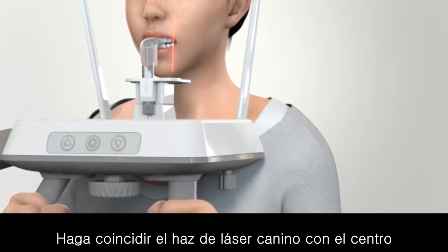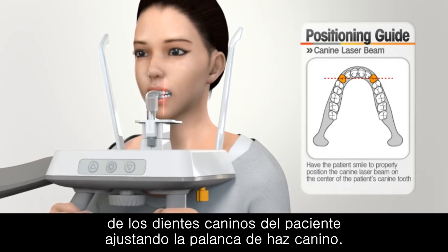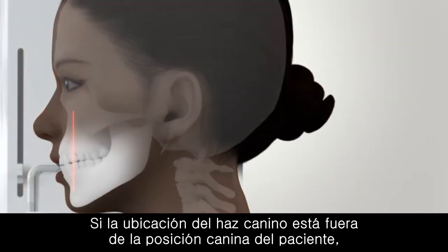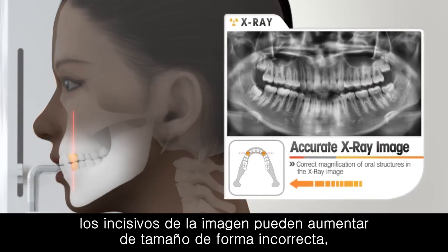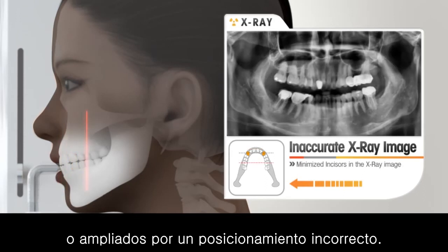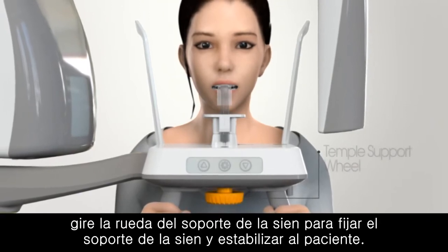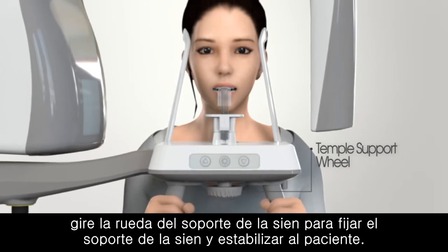Match the canine laser beam at the center of the patient's canine teeth, adjusting the canine beam lever. If the location of the canine beam is off the patient's canine position, the incisor image can be incorrectly magnified, which means reduced or enlarged incisor images are achieved by an incorrect capture layer. When everything is ready, rotate the temple support wheel to tighten the temple support to stabilize the patient.